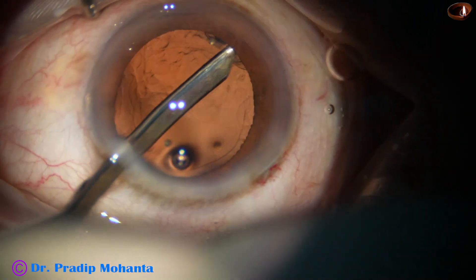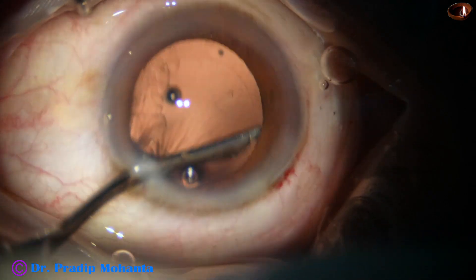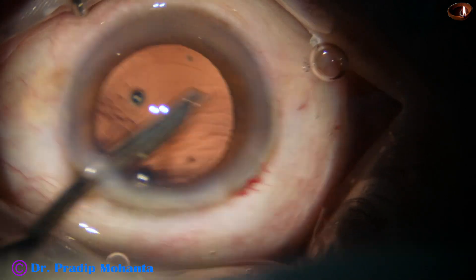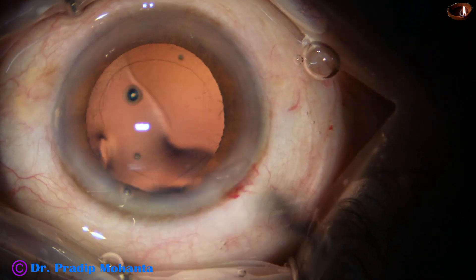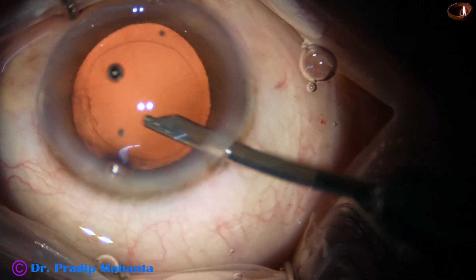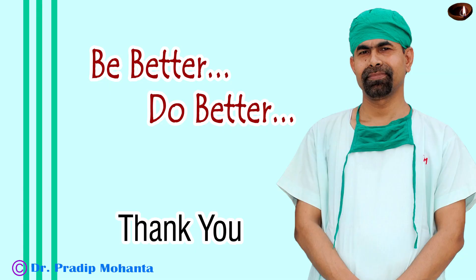If any remaining cortex is there we can remove it by Simcoe or by manual technique. Thank you very much for your attention. I hope this video will encourage you to use the pre-chopper — thank you very much for tuning in for this demonstration on managing soft cataracts.